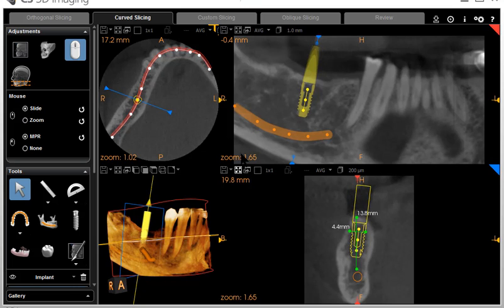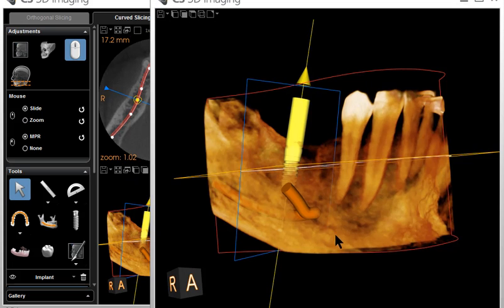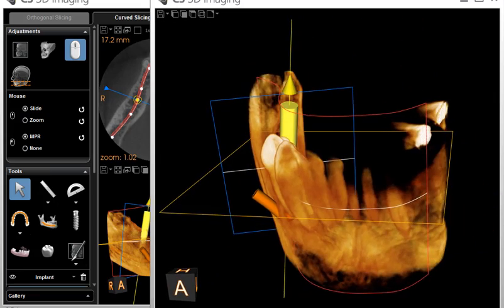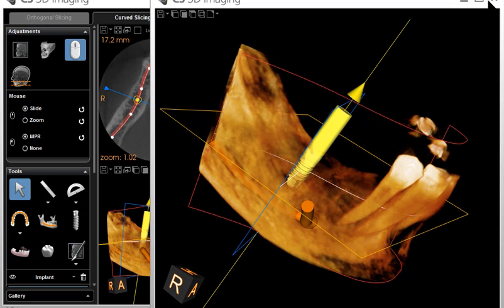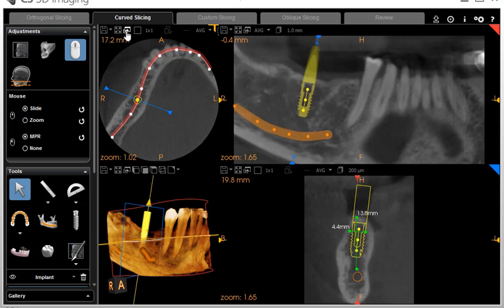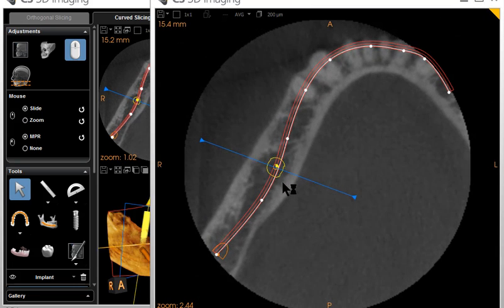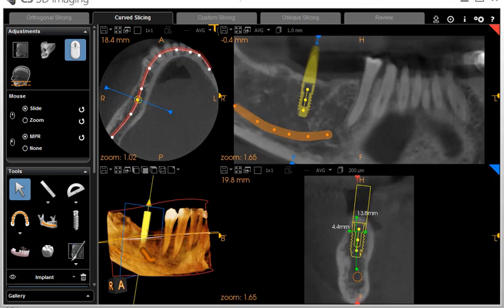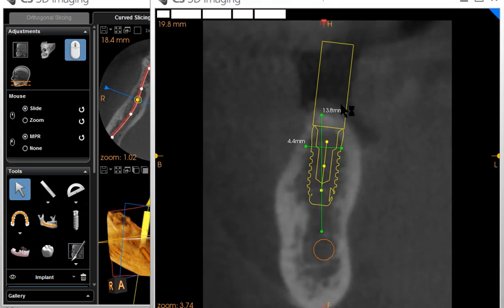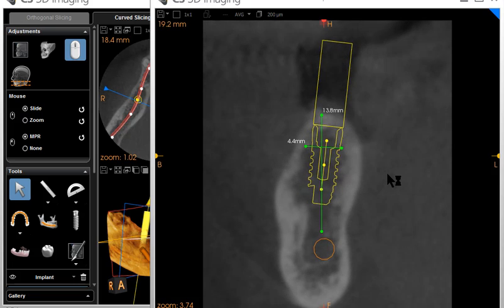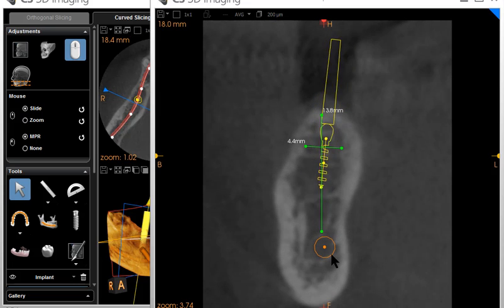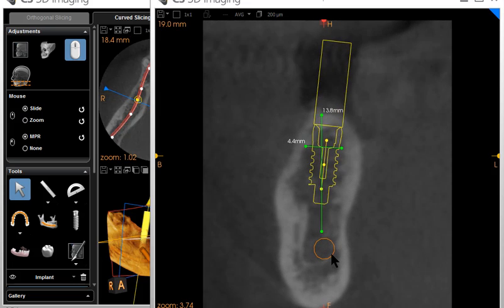Now you can change the angle of it a bit, and it is now in all of the windows. Here it is in the three-dimensional view. You can see how the long axis lines up and you can see if it's in bone. You can go to the axial slice and scroll through it to see that it's in bone all the way. You can go to this view down here, and as you slide through, you can see that it's well clear of the nerve and is in bone all the way.